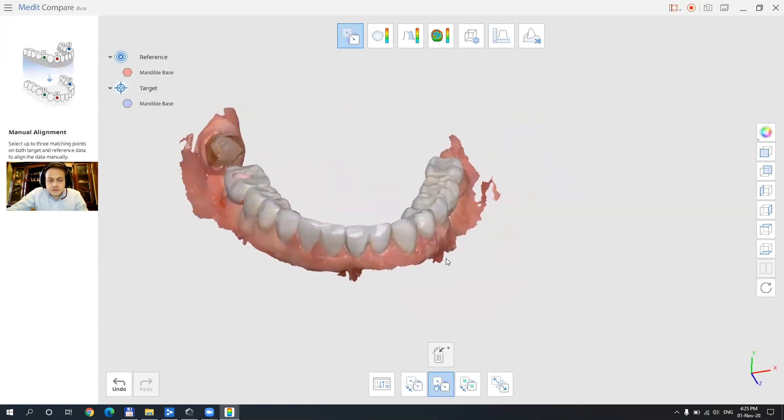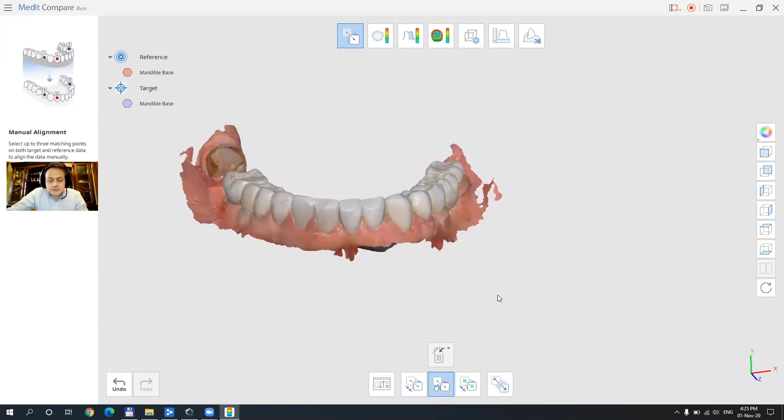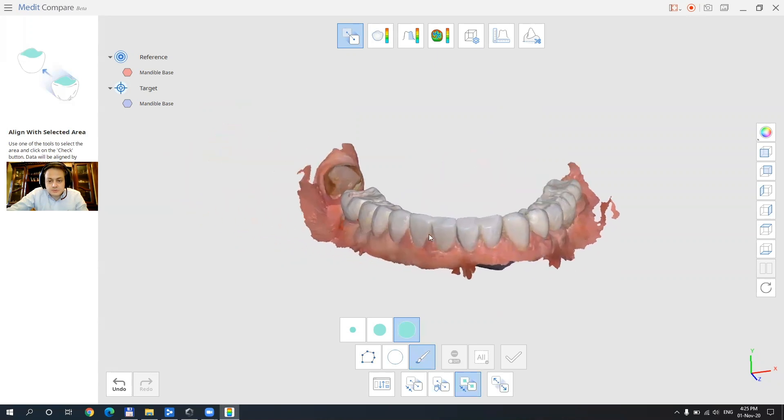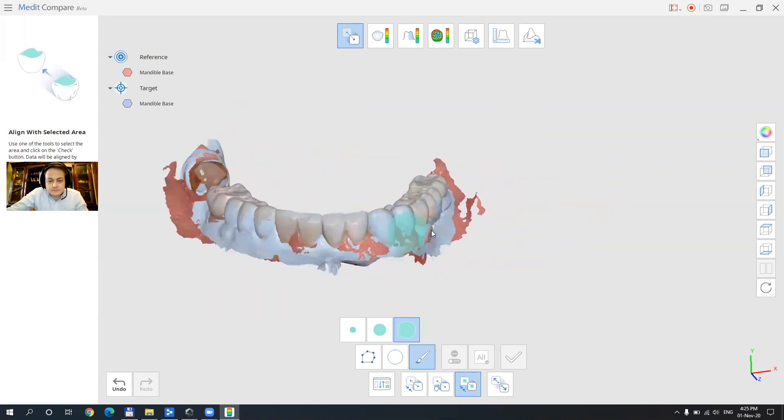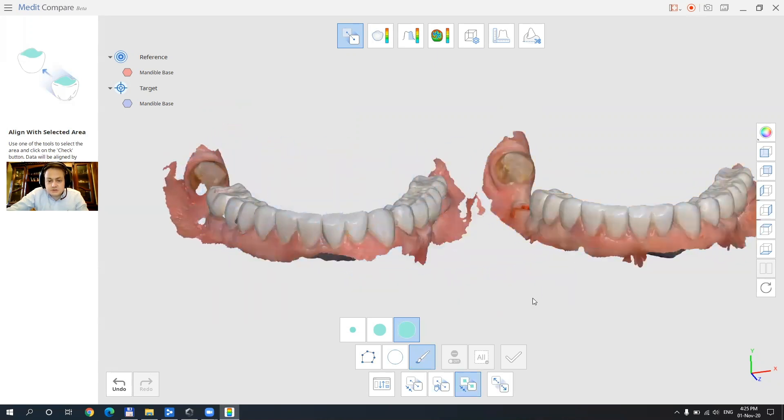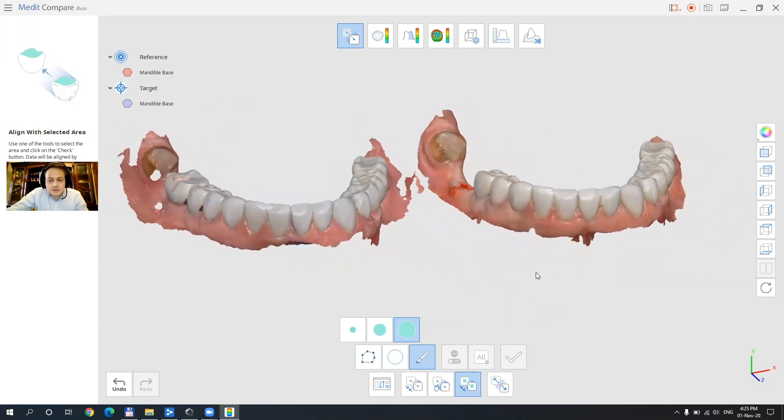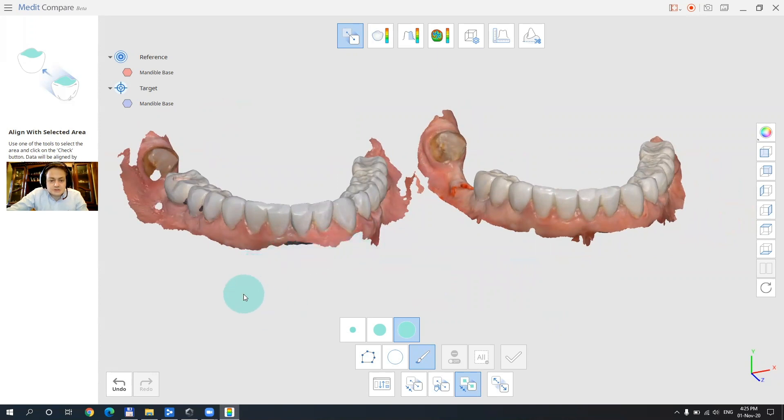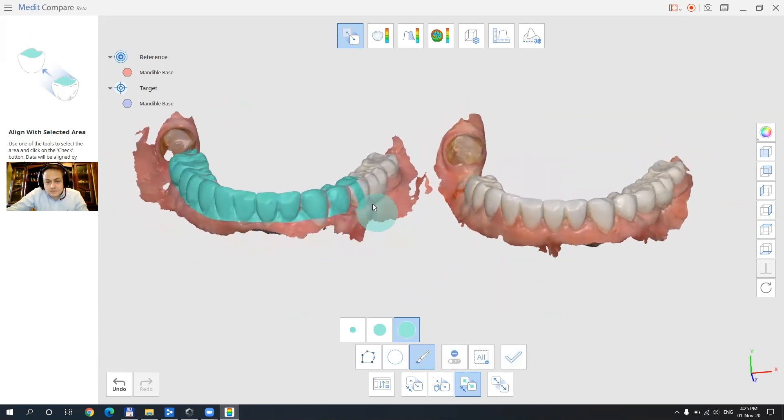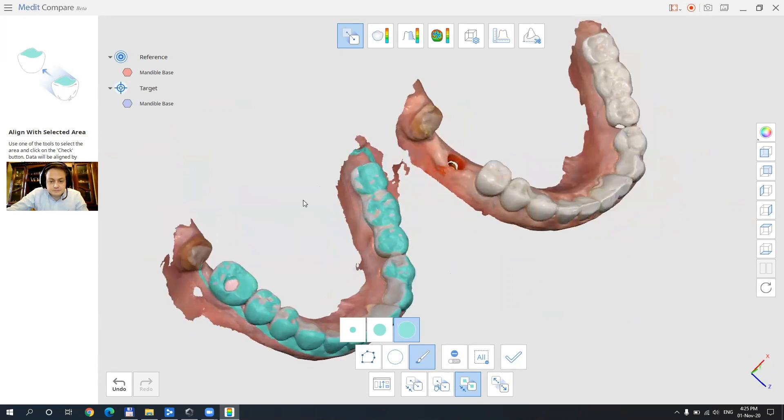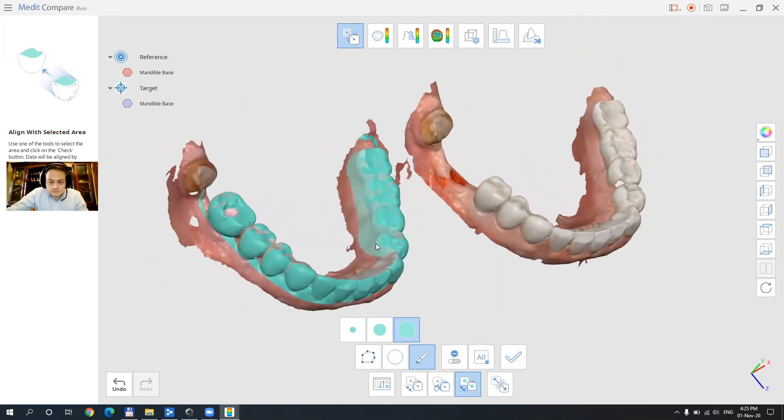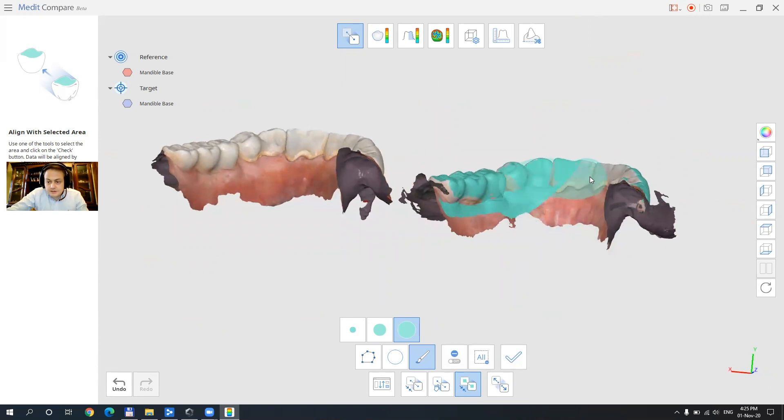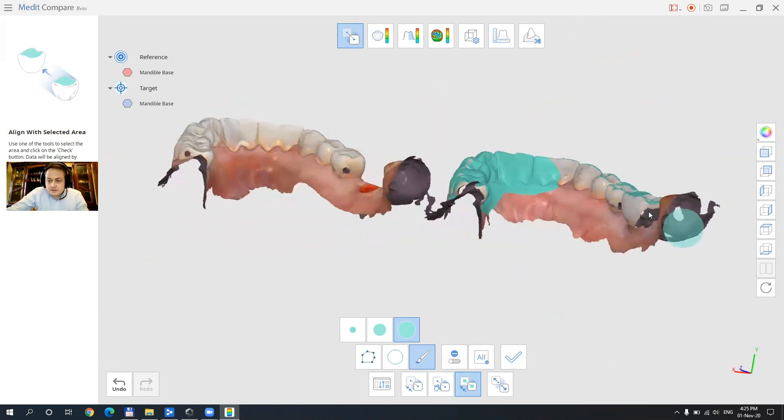So one more feature. Now a very nice one. If the arches need a little bit of tinkering with so that they align even better or if you just want to align by surface just click the third option. And let's just see how this works. And we're gonna align by painting surfaces that are common between the two scans. Let's just try with the teeth. Okay. Let's just see how this works as well.